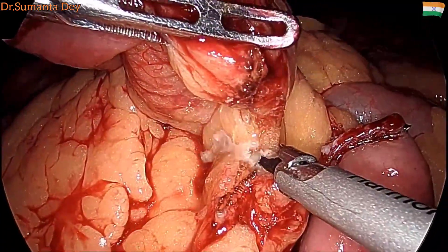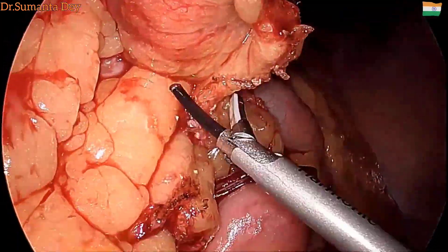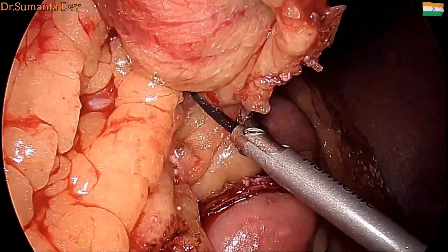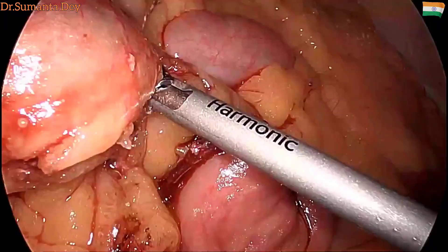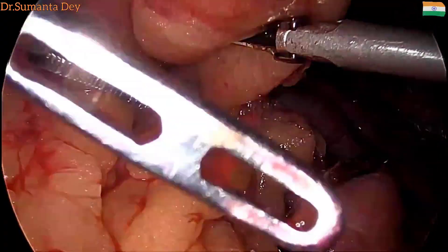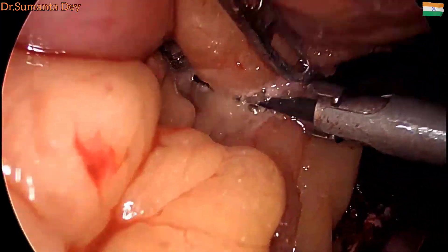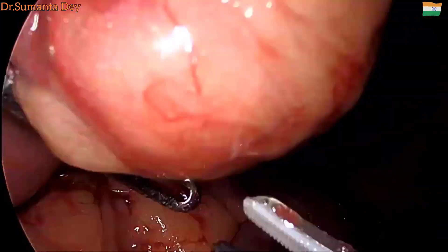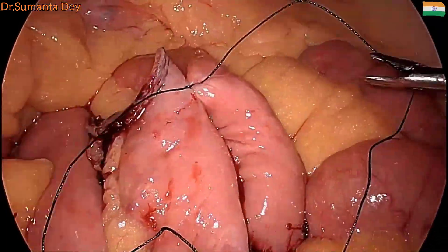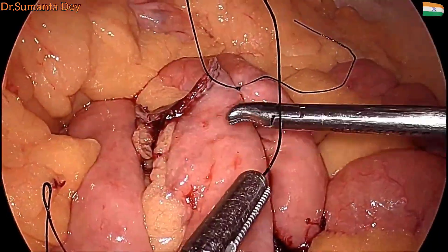After that, the mesenteric division was done, taking a clear margin from the tumor. The tumor was excised without breaching its capsule. Using harmonic shears, gradually and very gently the mesentery was divided with no bleeding, and the specimen was kept aside. Then side-to-side isoperistaltic jejunojejunostomy was initiated.